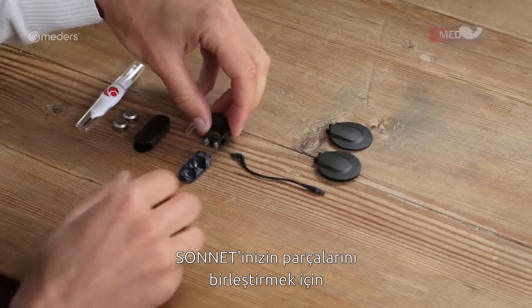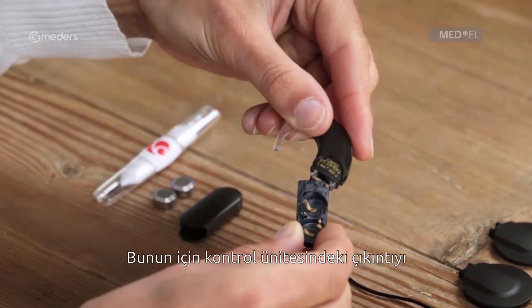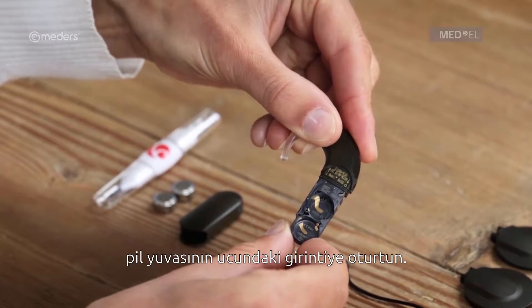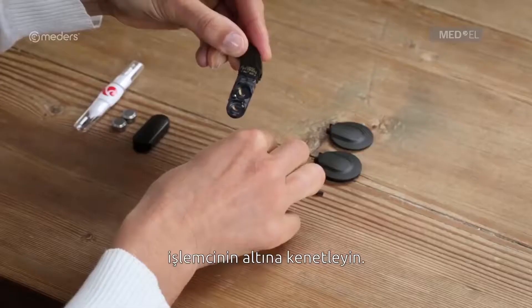To assemble your Sonnet, begin by attaching the battery pack frame to the control unit. Insert the hook on the control unit into the matching groove in the battery pack frame and push against the back of the battery pack frame until the release lever engages.